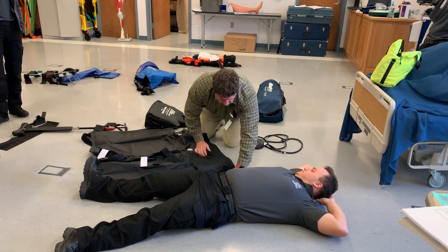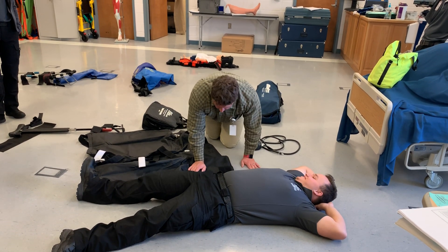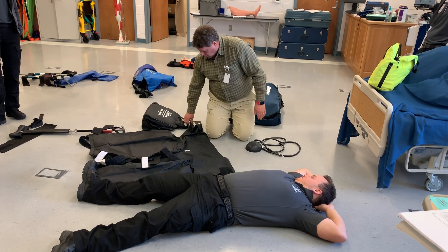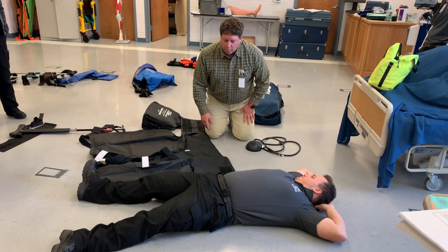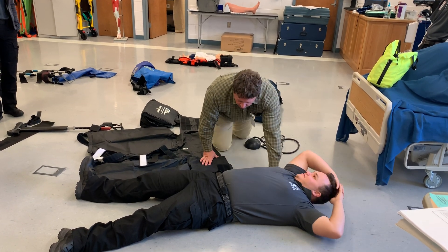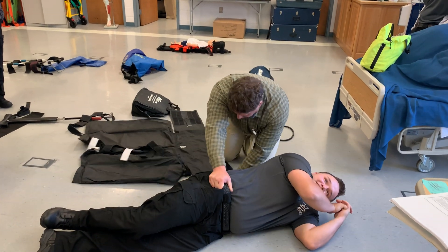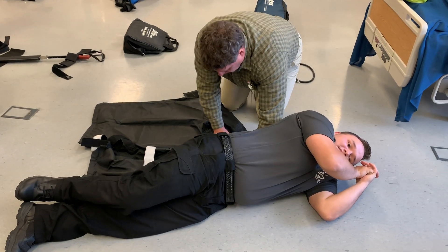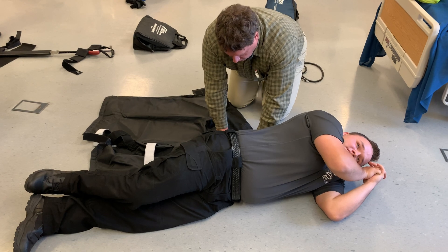You line these up and find out where the ribcage is, because we don't want to press on the ribs or press up on the diaphragm too much — we have to make sure we're below the rib cage. The garment has a marker for the spine. We'd log roll the patient with my partner's help, tuck the garment underneath, and try to account for where the spine is going to be, not going too high.